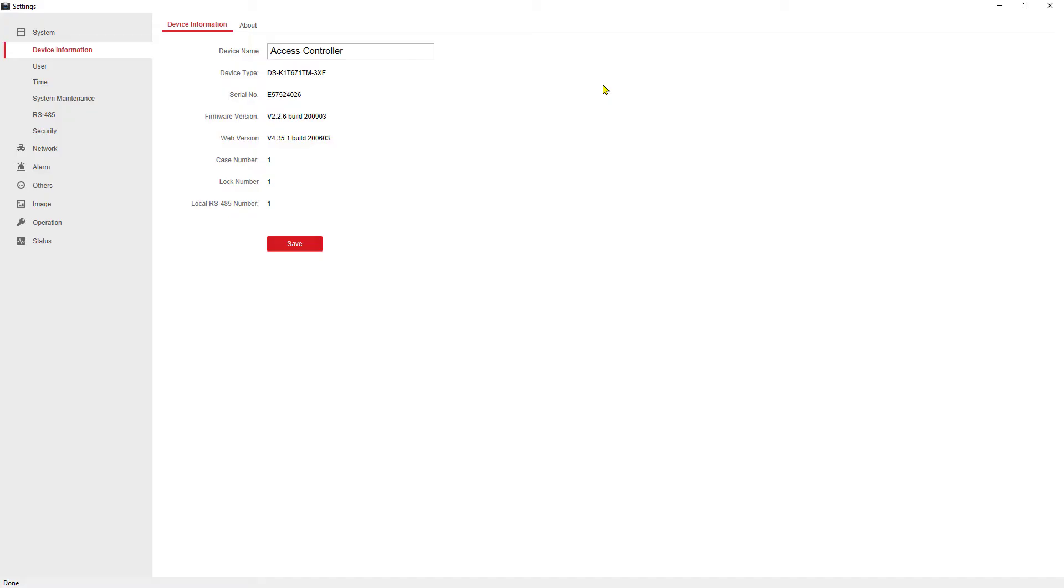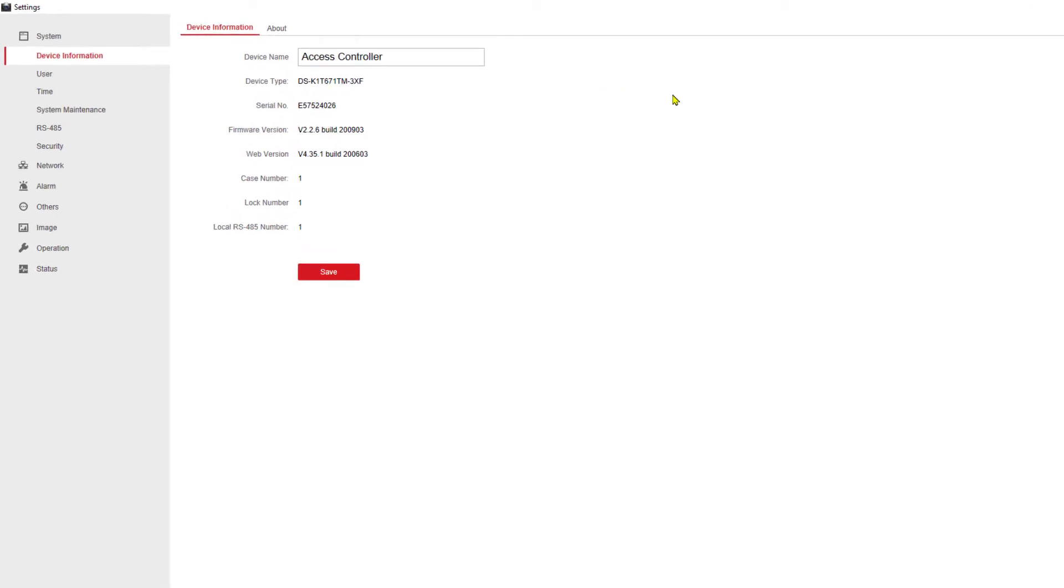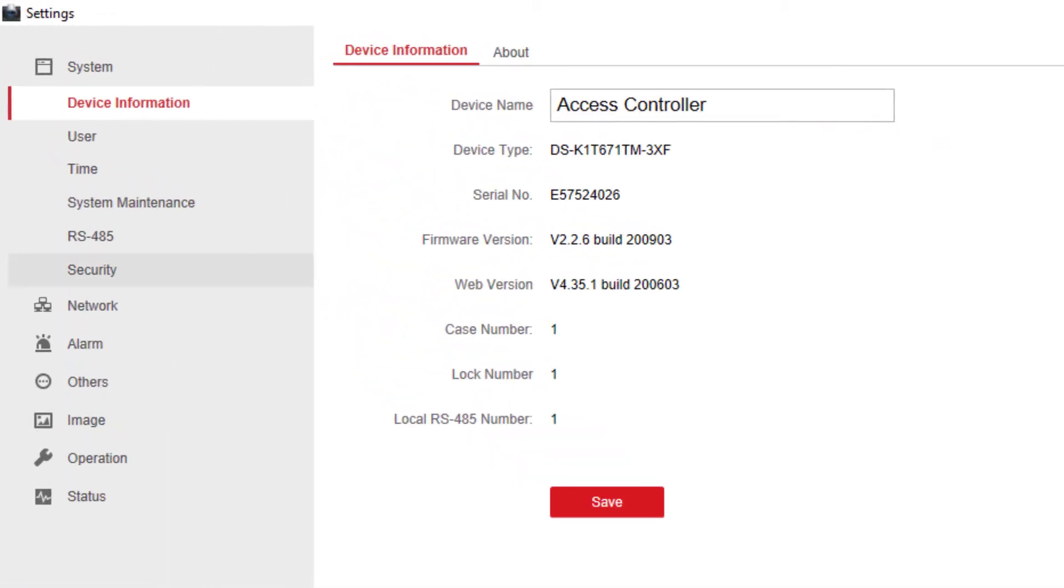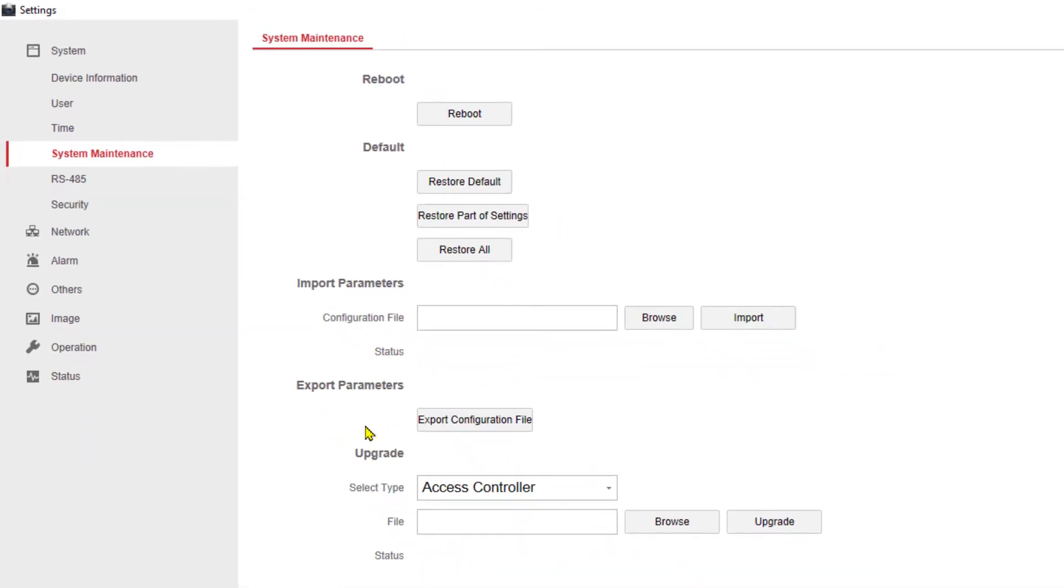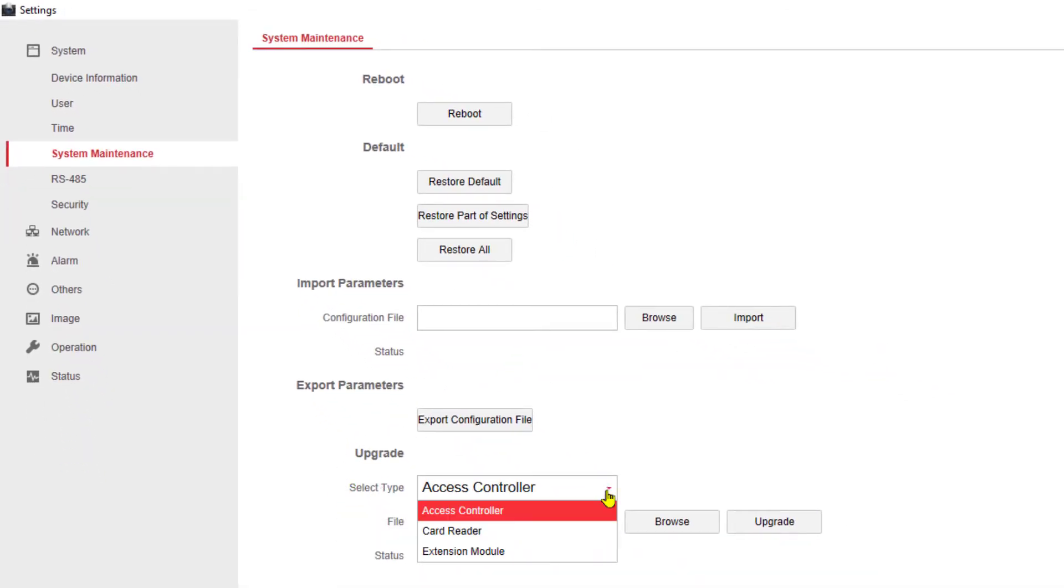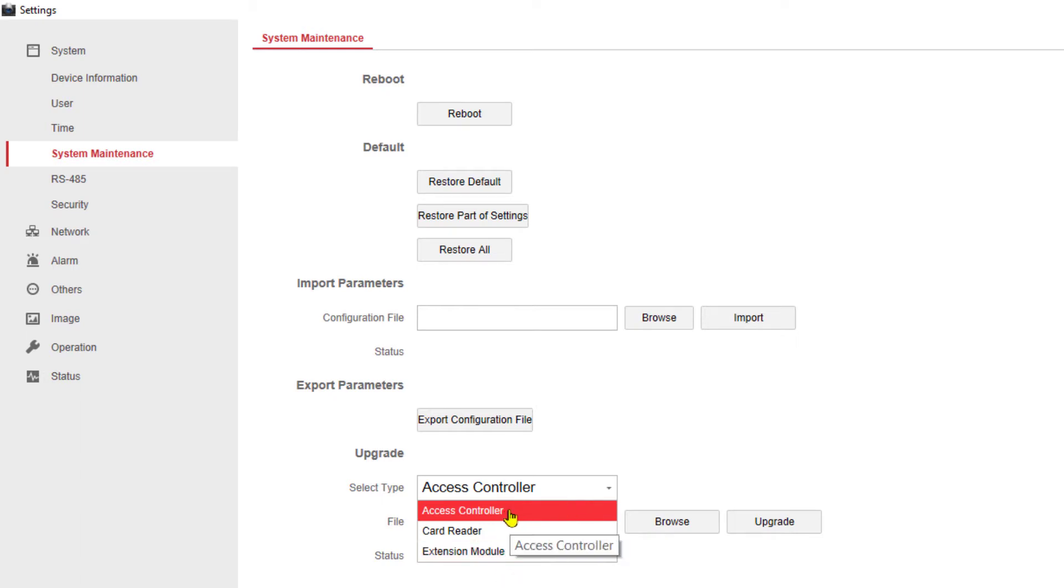So I'm going to go to the remote configuration icon here and I'm going to open this up. This is going to allow me to do remote configuration or in this case the upgrade of my temperature screening terminal. So I'm going to go to the system maintenance section, and here is the upgrade section. If I click on select type, I have access controller and extension module.